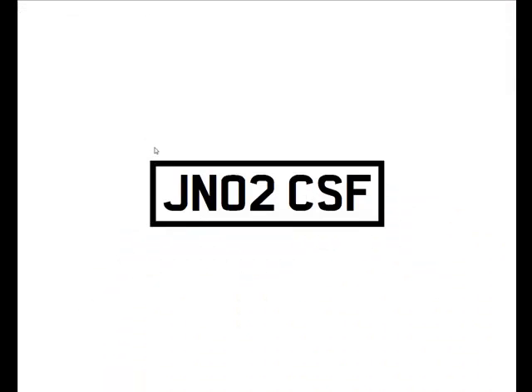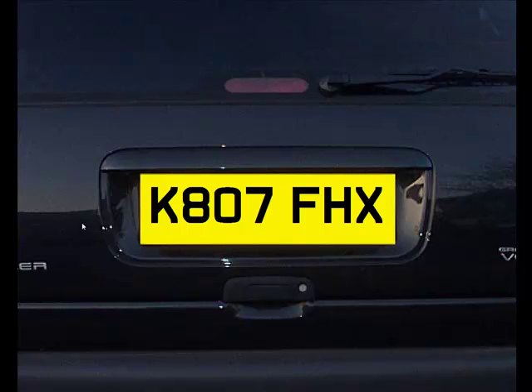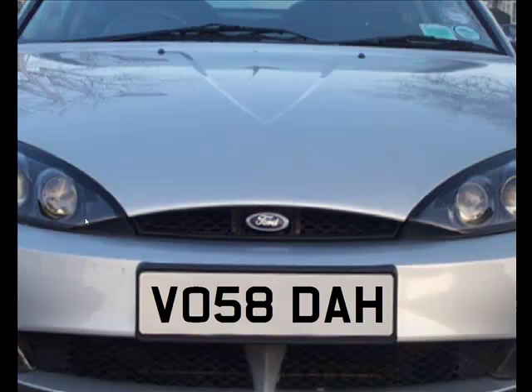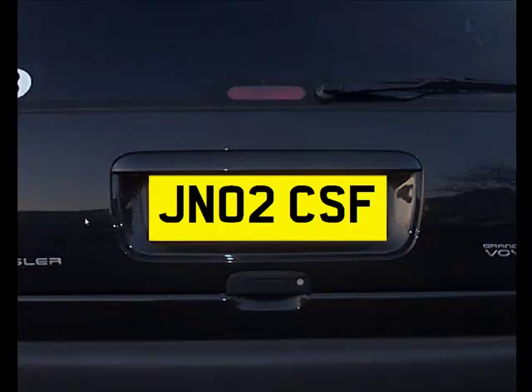You've then got the number plate, the registration plate, the statutory test for vision for driving in the UK. This is a proper number plate using the correct fonts and the correct spacing. This is about as close as you can get to the real thing without taking the patient out to the car park. You can put the number plates on different backgrounds and you can have front and back number plates. You can even look at the number plates on a car. This gives it some face validity.